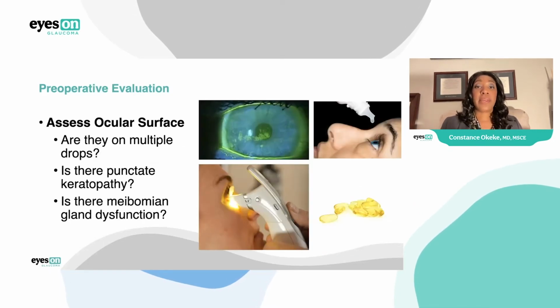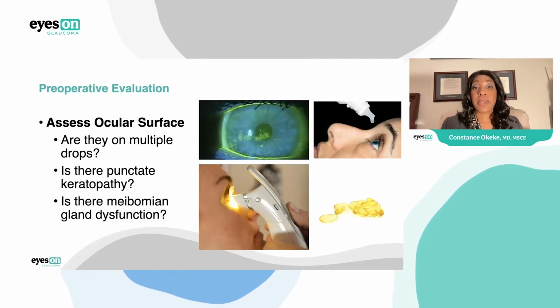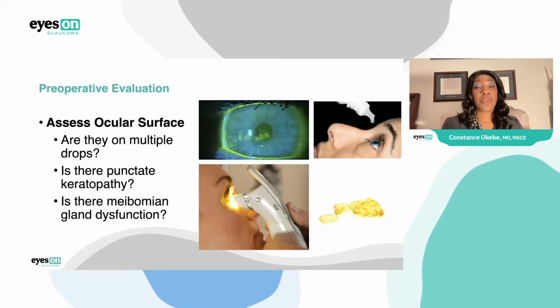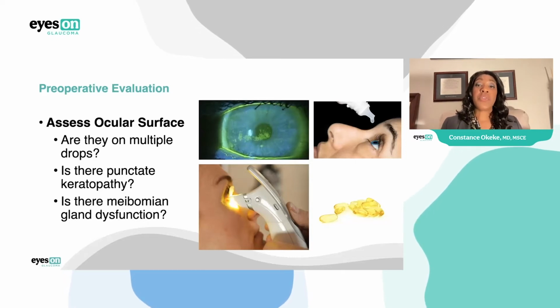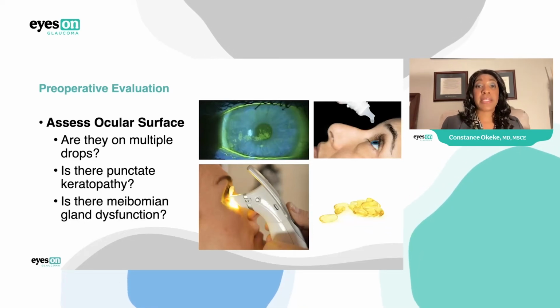Then we're also looking at the slit lamp, looking at the corneal surface. We're looking to see if there's any kind of corneal staining and if there is any kind of meibomian gland dysfunction, because these are aspects of the overall outcome that we need to address, and we might have to address them early on with the use of artificial tears or punctal plugs or utilizing preservative-free medications or vitamins or procedures that help with meibomian gland dysfunction like LipiFlow or iLux or Blefex. So different things that we might need to do to treat the patient to help them to get that best outcome.